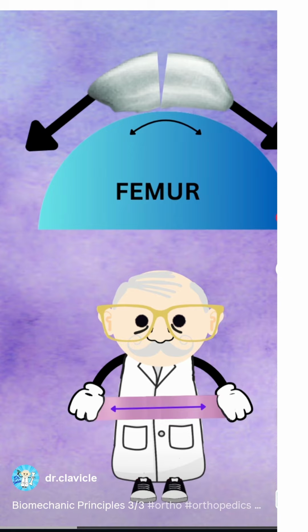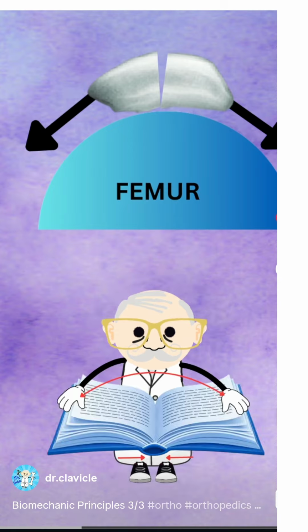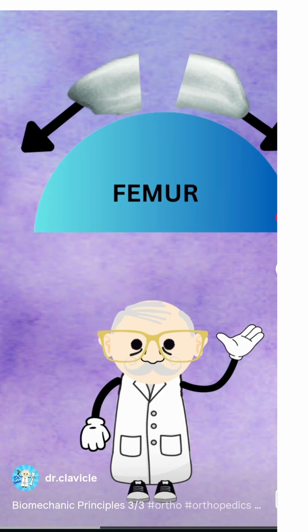That bending makes the fracture behave like a book. The anterior surface is the side that tends to gap open under load, and the posterior articular side stays closer. Without a tension band, the anterior side is free to open. Contact at the fracture site is lost.